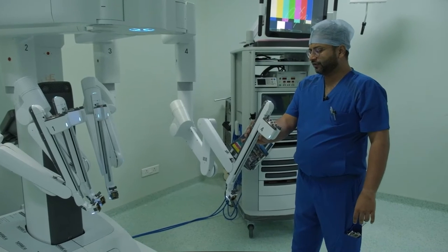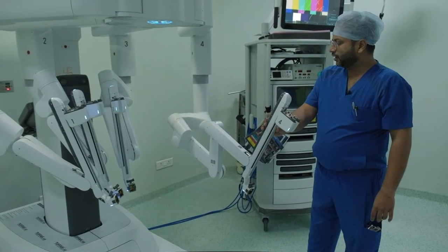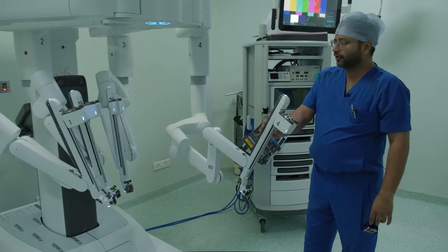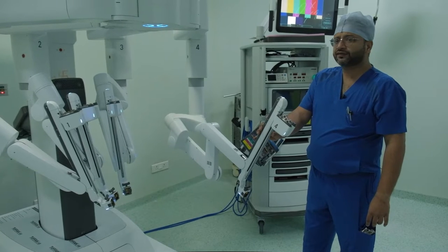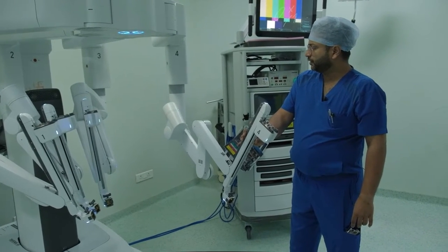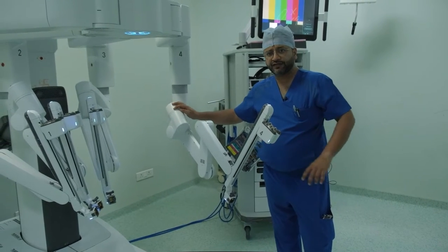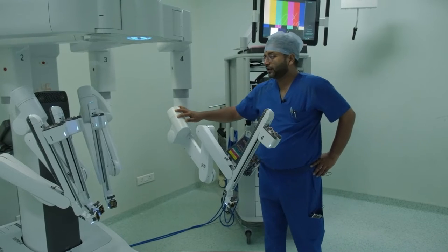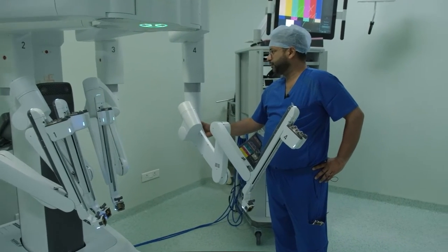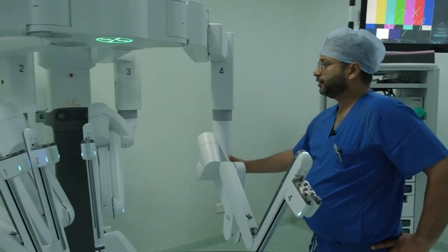There is a patient clearance button here, and once we press this patient clearance button, the arm is going to rotate itself. If there is any external arm clashing, we can press this patient clearance button and we will be able to rotate these set of joints so that the clashing does not happen. There is something called a boom rotation button here. So this boom can actually rotate.